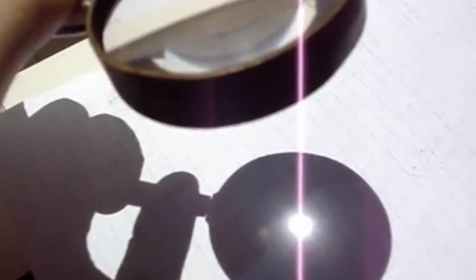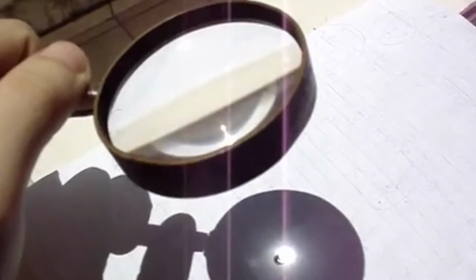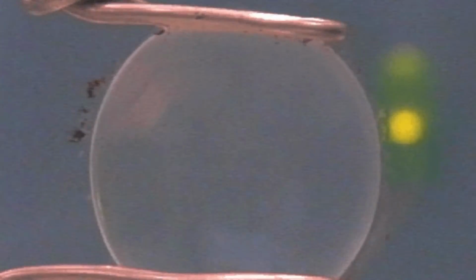So under HIFU conditions, the idea is to focus ultrasound to a location inside the body, the way you would do with light and a magnifying glass to burn a hole in a piece of paper. So in ultrasound you can do the exact same thing, but you can focus the sound waves through the intervening tissue to the spot, the region of interest that you're trying to heat. And that's typical HIFU: you're generating a temperature increase enough to kill the cells.